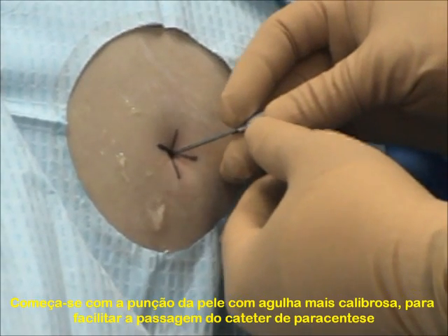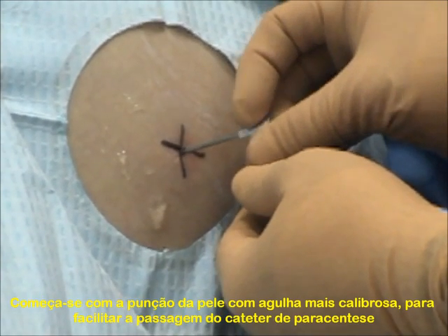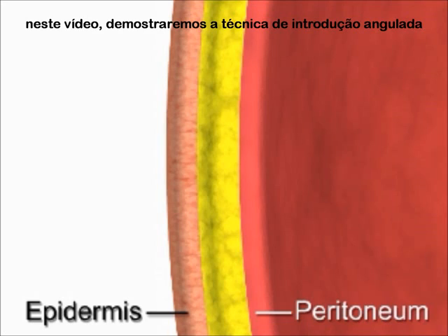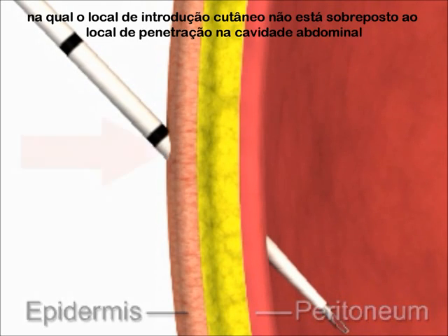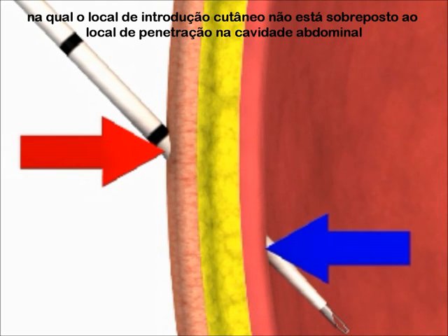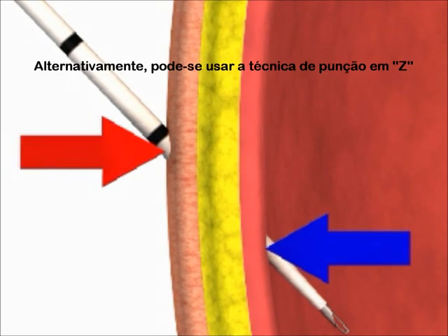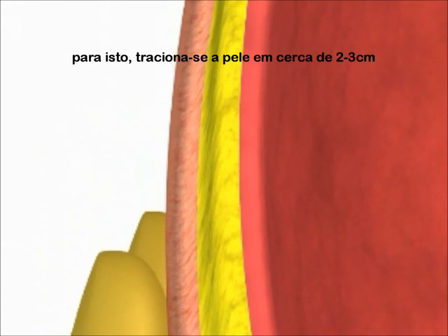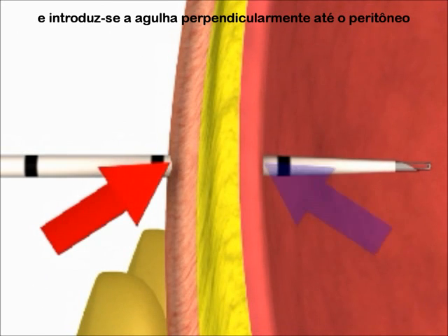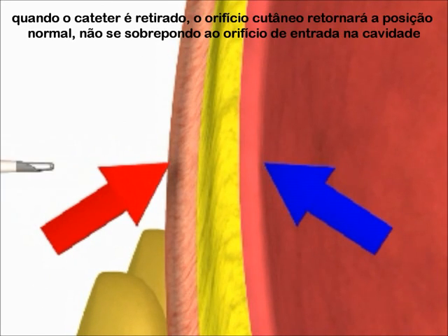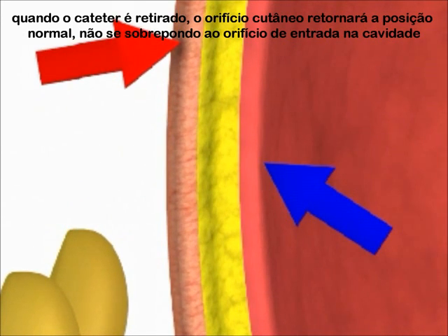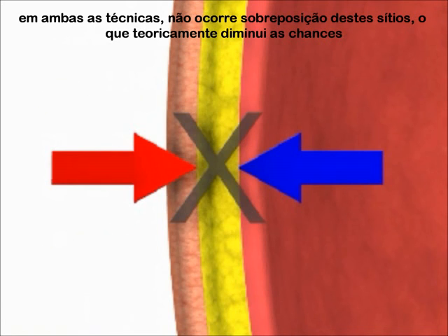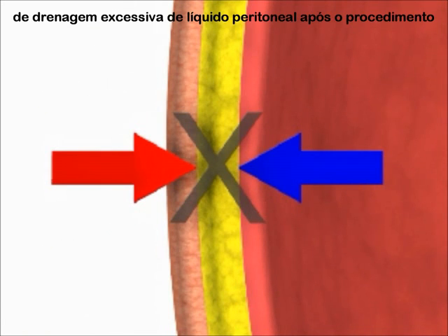Begin by making a small puncture in the skin with either a scalpel or a large gauge needle to facilitate advancement of the paracentesis catheter. Next, advance the catheter through the epidermis. In this video, we will demonstrate an angular entry technique in which the cutaneous site of insertion does not directly overlie the site of penetration into the peritoneal cavity. Alternatively, a Z-track technique may be used, in which the cutaneous tissues are pulled two centimeters caudad prior to needle insertion and advancement through the peritoneum. When the catheter is withdrawn at the end of the procedure, the cutaneous entry site will retract to its original position. Both techniques ensure that the cutaneous and peritoneal insertion sites do not directly overlie each other, theoretically minimizing the risk of ascitic fluid leak following the procedure.